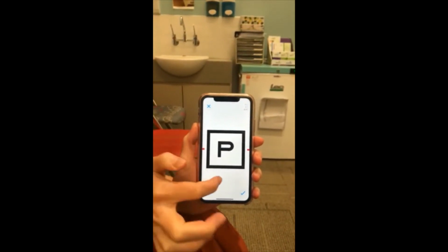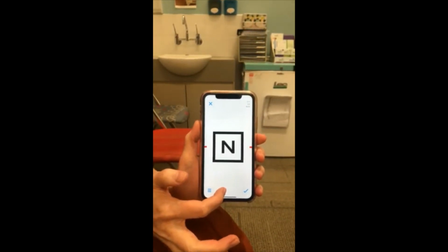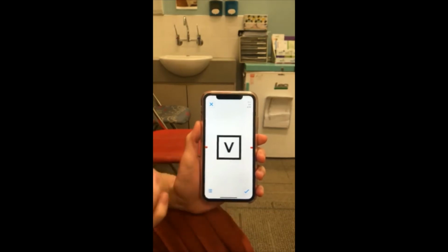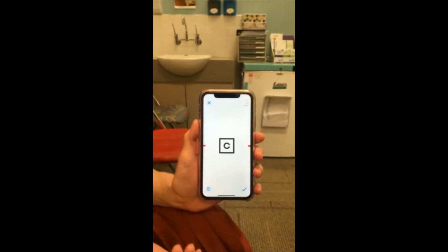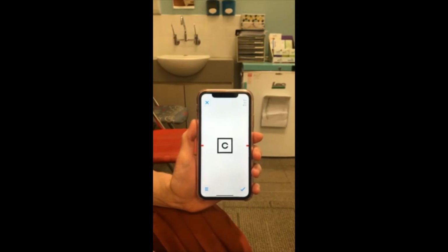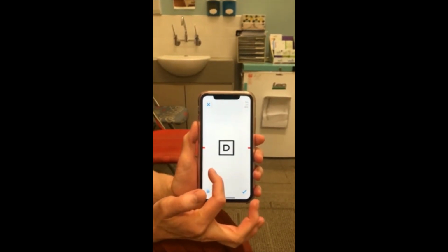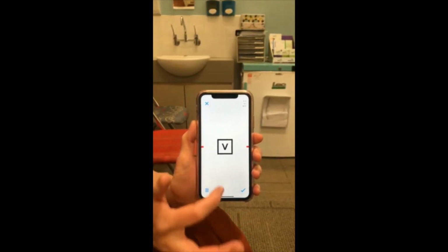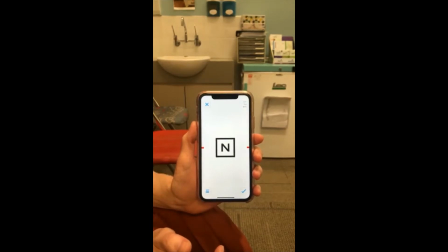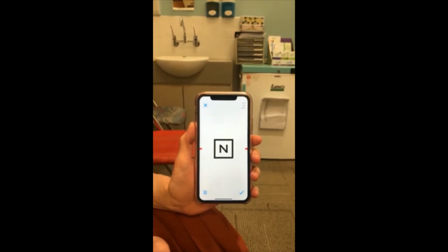Start with the biggest letter, and then go smaller, and each time your child gets a letter right, go smaller again, and go smaller again. There'll come a point where your child starts to struggle or starts to get the letters wrong, in which case give them a few different options. If you're getting them all wrong, then you know they can't see that line. But if they can see the one beforehand, which they were getting correct, that is the score of your vision.